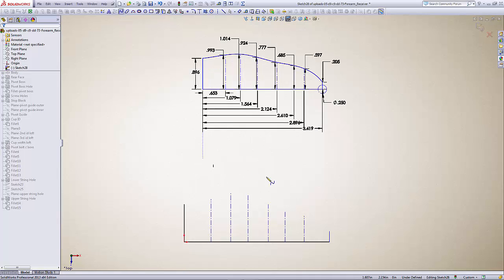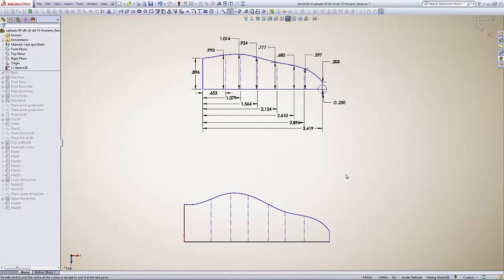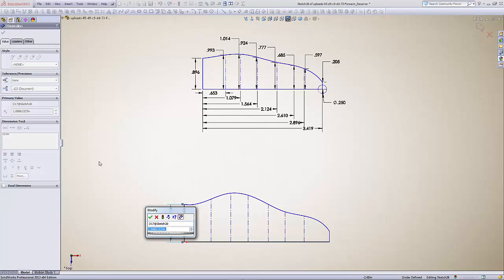We'll grab the spline tool and start at the right-hand side, clicking at the end of each line and up to the end of the next, continuing down through all the lines until we get to the end, then hit Escape. Now we'll go through and dimension these lines, which will give us the proper shape of our spline. One important thing: we want to make our dimensions from the point at the end where the spline line goes through the drawn line. So the first dimension is 0.896 — enter.